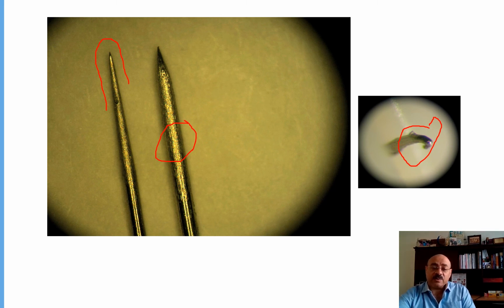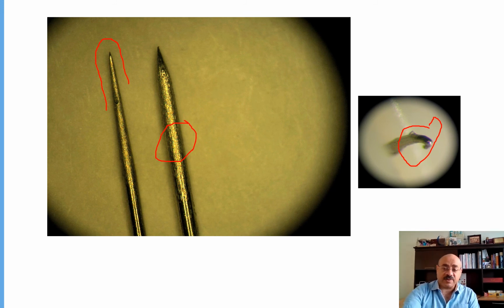And also, I would like to highlight that the tip of this and also the dermal roller is single use. So we should not use it more than once, even if it is for the same patient, because with the wear and tear, even the good quality needles will have this effect, and it is not healthy, not good for the skin.